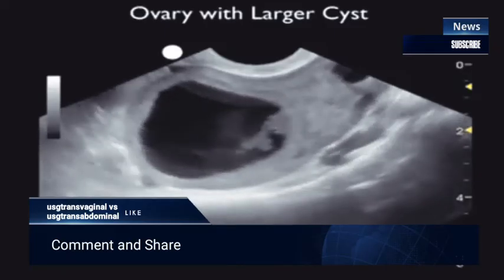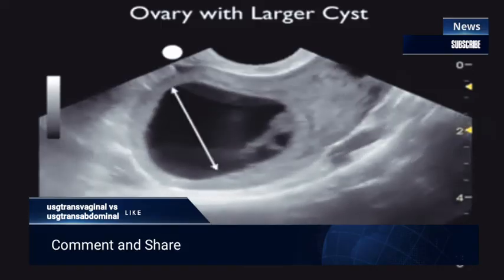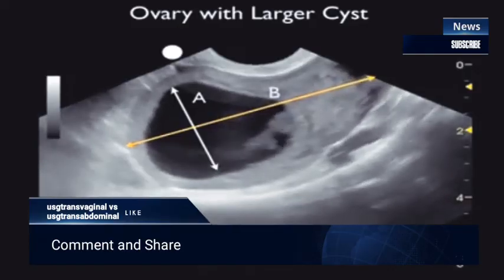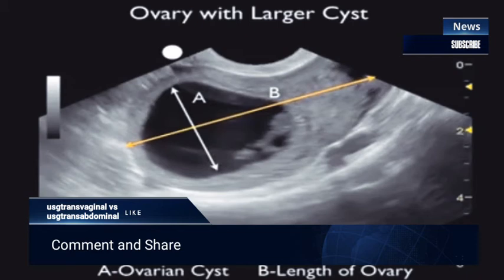In this video, we see an ovary with a very large cyst, and as we scan back and forth, we notice that the cyst has a hypoechoic or dark appearance in the interior of this ovary. Now remember, when we're measuring an ovary and a cyst, we want to first measure the internal dimensions of the ovarian cyst as indicated by the marker A. Then we want to measure the total dimensions of the ovary as shown in marker B.